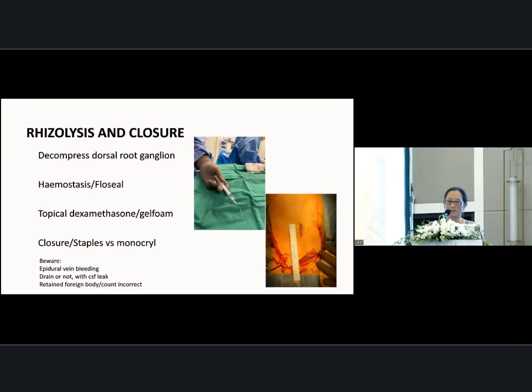Possibly it might lead to extra tethering and scarring, but I've not really noticed that currently with my patients. I do notice that a patient who's had a number of cortisone injections before surgery, there does seem to be a fair bit of tethering, whether that's due to cortisone or whether it's just due to the duration that the patient has had an inflamed disc. It's up for conjecture. So make sure the epidural bleeding has stopped.